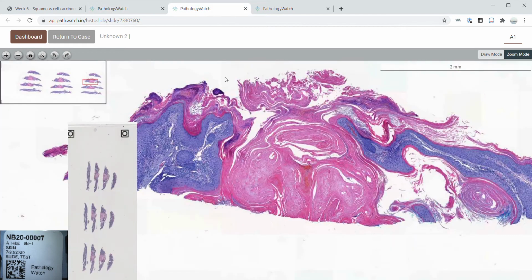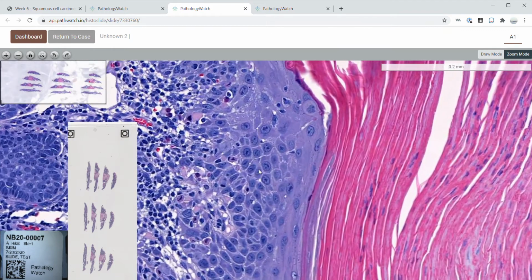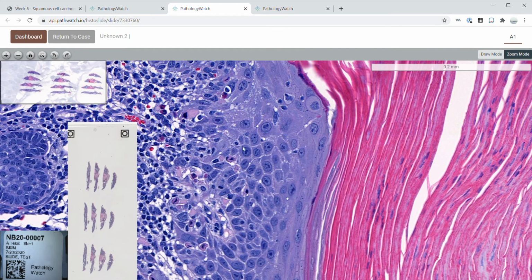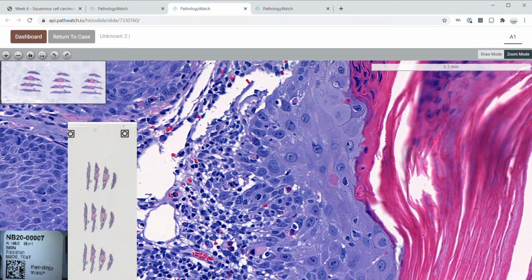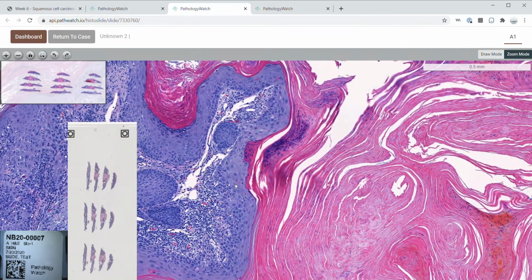This is one form of well-differentiated squamous cell carcinoma, known as a keratoacanthoma. It is defined as having rapid clinical growth and resolution. You can see here there's a keratin-filled crater, and surrounding the keratin-filled crater are atypical keratinocytes. Very commonly, these have a glassy cytoplasm. Sometimes you can have neutrophils involving the atypical keratinocytes as well as trapping of elastic fibers. Multiple KAs are seen in the syndromes of Grzybowski, Ferguson-Smith, and Witten-Zak syndrome.